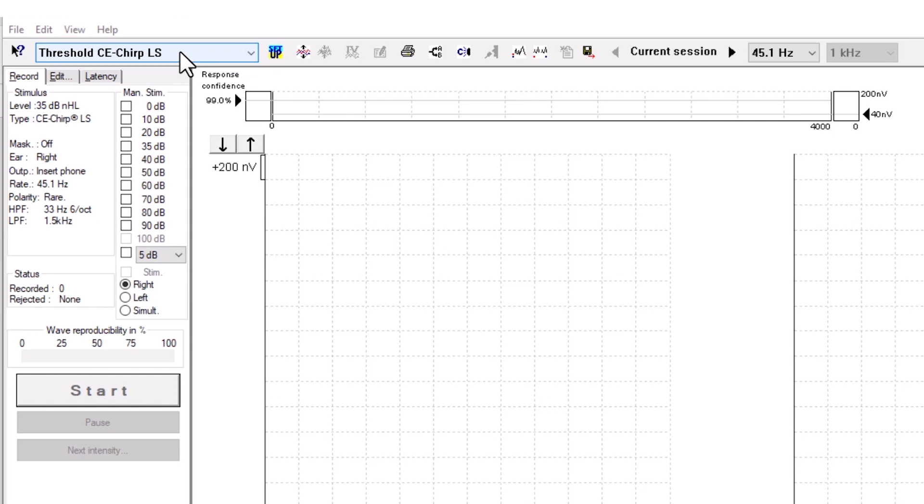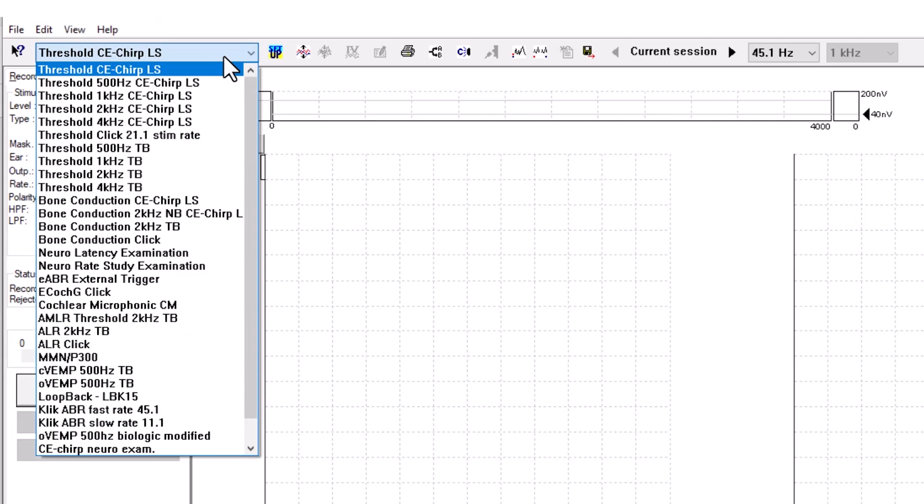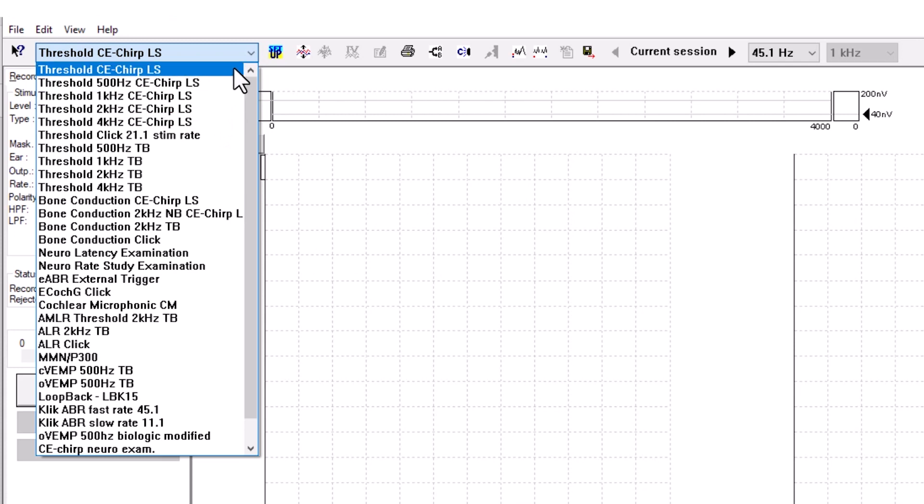This is the protocol drop-down menu. Here you can change to the different protocols installed in the Eclipse software. Please note that if you have already made a measurement, you have to close the software and open it back up again to change the protocol.